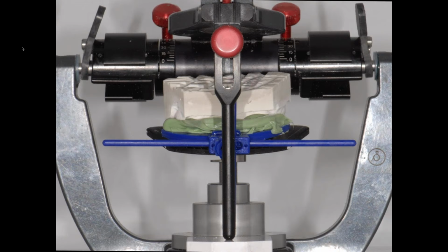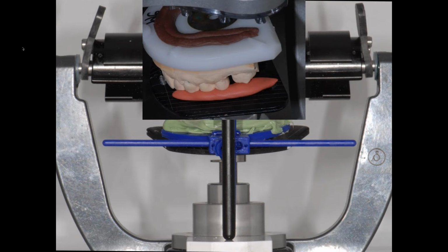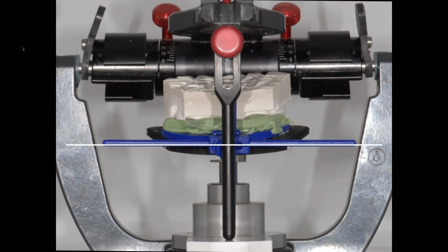So if we put this on our face bow and this stick is not horizontal, well, the face bow is not correct. Then we have to backtrack and figure that one out, talk with the doc about what do you want me to do here, this is not correct. And in this particular case, we can see we've got to lift up the left side just a little bit to get that stick straight. And there is a new occlusal platform that allows you to tilt it left to right a little bit to accomplish this. Back in the day, we would use a little bit of putty, whatever it takes to get the stick straight. Once you get the stick straight, now you know that your incisal plane is going to be exactly the way it was in the mouth, so long as the doctor got the stick straight. We depend on each other to do this right.